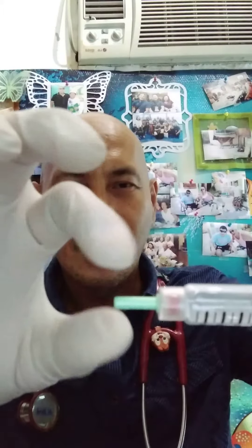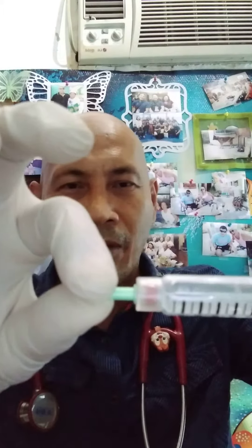You just open this one, remove the cover, and you'll have your very small fine needle for your insulin pre-filled syringe injection.